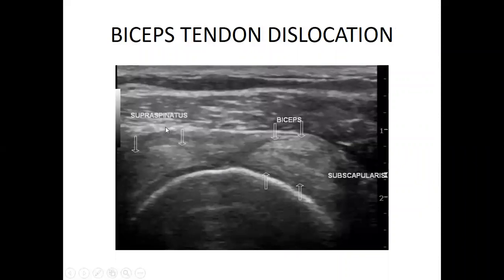You can see now this one was well picked within the anterior compartment with the arm, the elbow pointing behind, the palm put on the back.